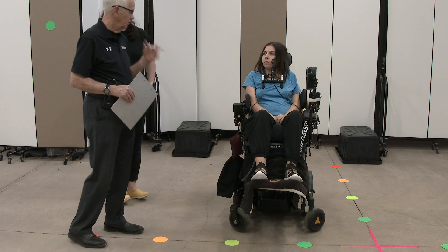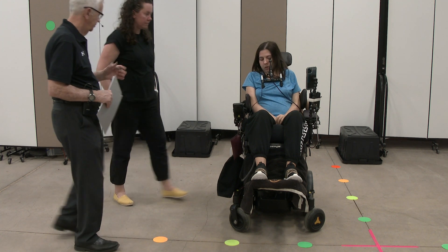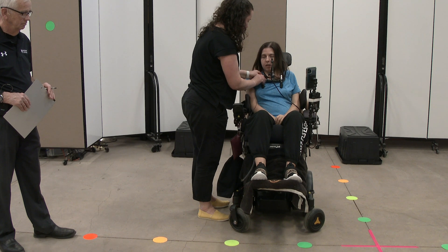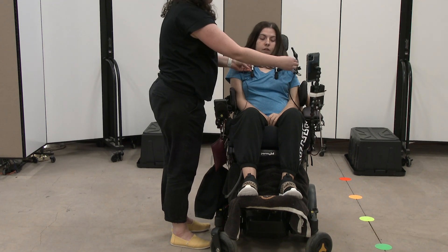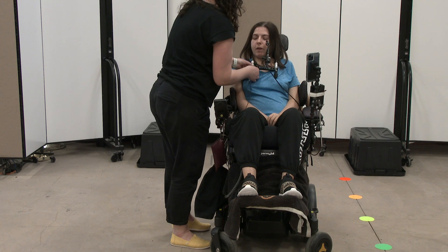Now how about the controller for your... Can't do, but I can explain. So the little black piece that is right there, there's a snap on the back. If you unsnap it, and then just pull it over, and then pull it back up, and it snaps right back in.